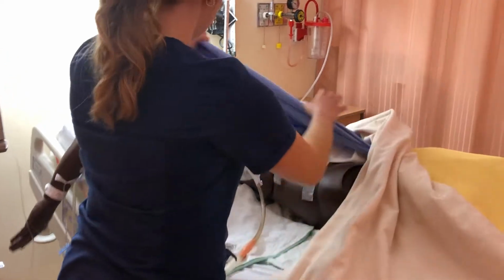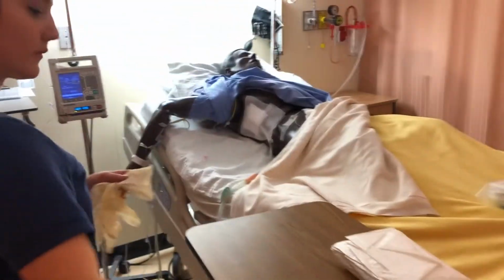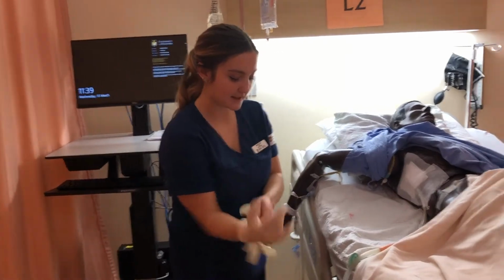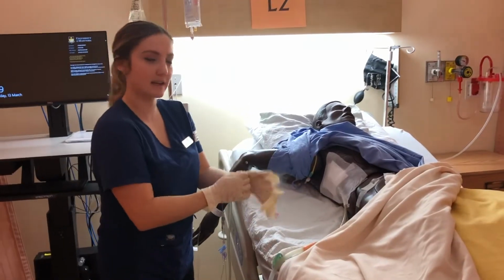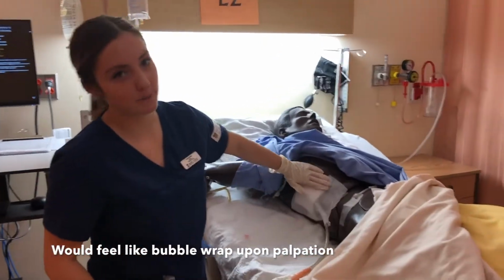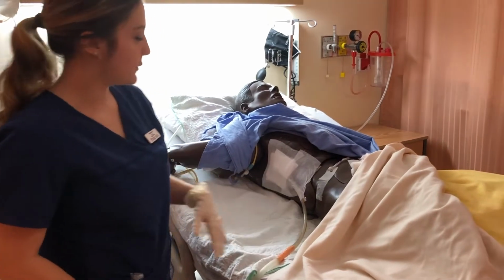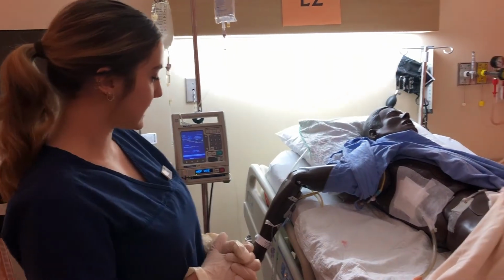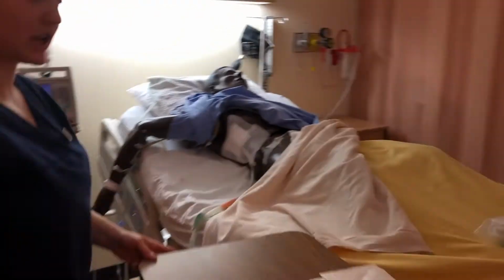Now I will expose the chest tube site. I've done hand hygiene, so I'm just going to put some gloves on now. I'm going to first assess outside the dressing what the site is like, assessing for any subcutaneous emphysema because that indicates that there could be a leak somewhere into the chest cavity, but it feels good. I'm noting the color and if there's any excessive drainage leaking through the dressing, but there isn't, and it looks good. So I'm going to go ahead and set up my tray and then change the dressing.